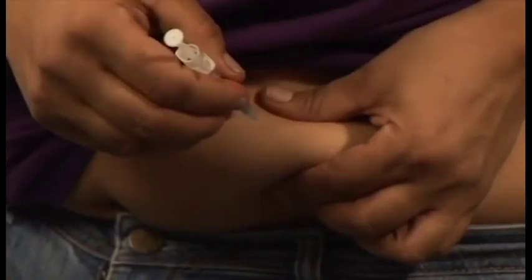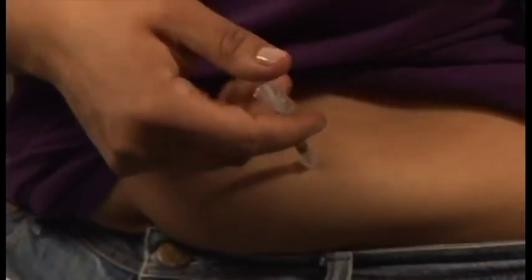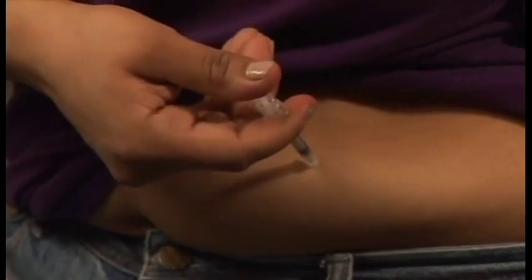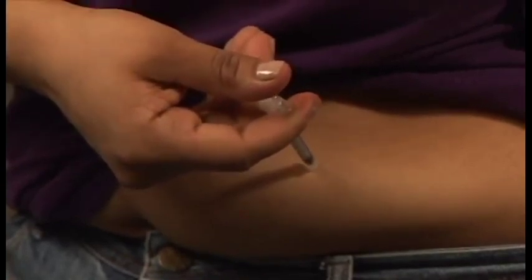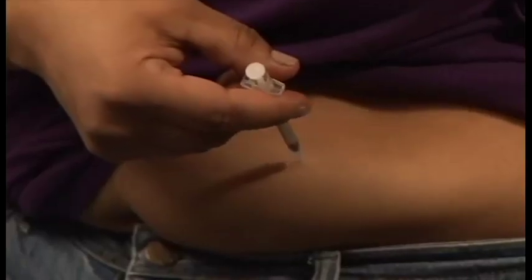Lightly pinch the injection site and hold firmly. Insert the needle straight into the skin the way you were shown. Let go of the skin and push the syringe plunger all the way in with a slow, steady motion. Inject the full dose of insulin. Wait 10 seconds. Remove the needle by pulling it straight out of the flesh.